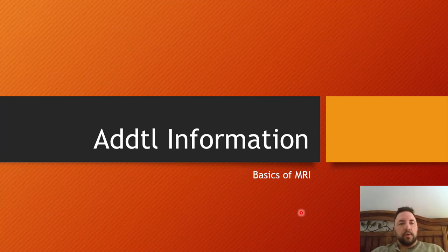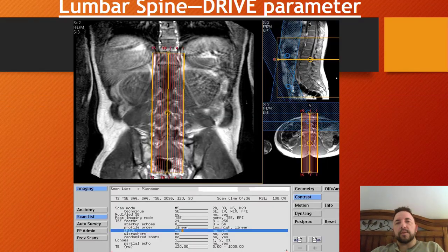Okay, folks, we're gonna do a quick finish up to the spine series, where I just wanted to touch up on a last piece of information where we discussed the concept of driven equilibrium. Specifically, when we talk about driven equilibrium, we're talking about one of the few freebies in MR, where we can preserve contrast or keep a short enough TR period and still gain excessive enough or bright enough signal from fluids.